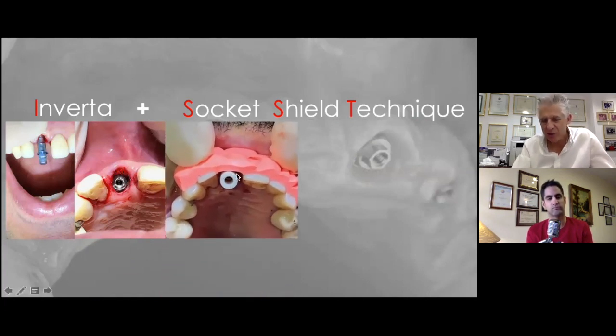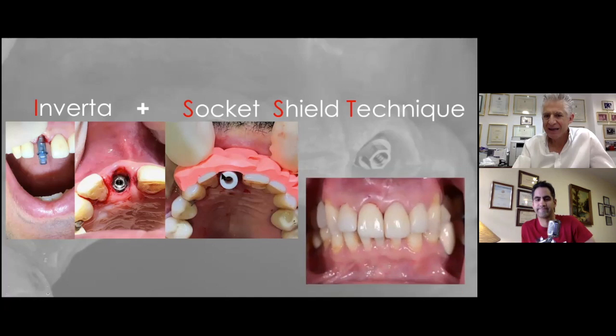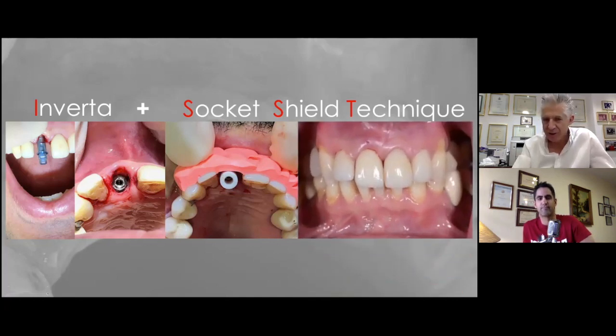The way we do it is we place a pre-sintered post-ground zirconia cylinder here, and we have a look that we have the right position. We verify that it's for screw-retained implants. We verify that it's wide enough not to have unsupported porcelain. And within 4 hours, our dental laboratory is able to cut this down and add porcelain and give us this tooth within about 4 hours. And that's our final prosthesis.